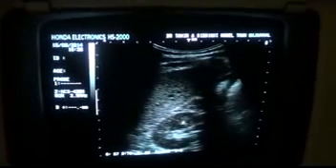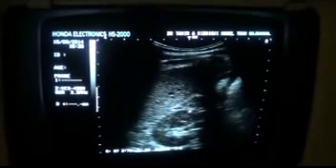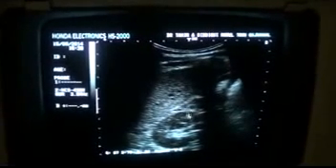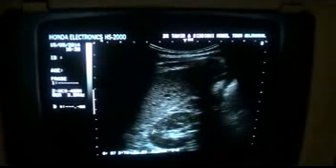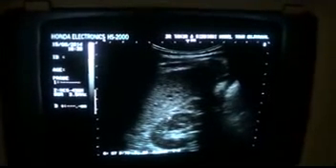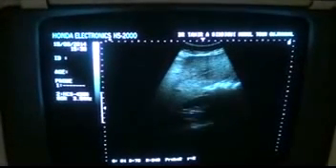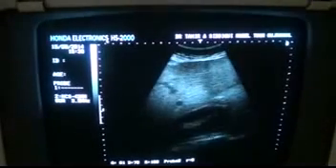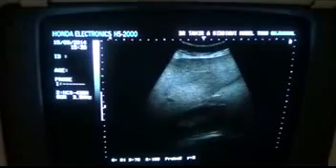You can see this small cystic area is the pyramid, and this is the cortex. So, intact corticomedullary differentiation with normal parenchymal echogenicity. Thank you very much. This is a video segment for the study of the comparison of the renal parenchyma with that of the adjacent liver.